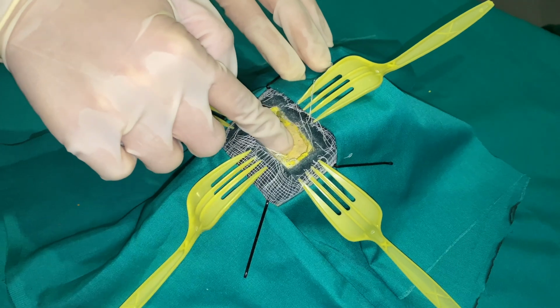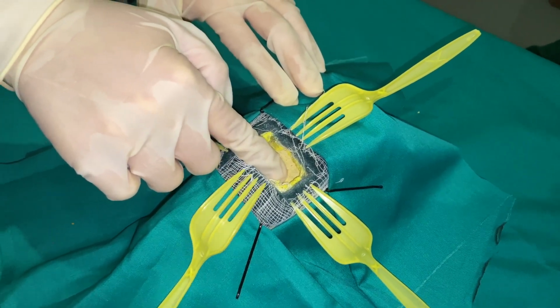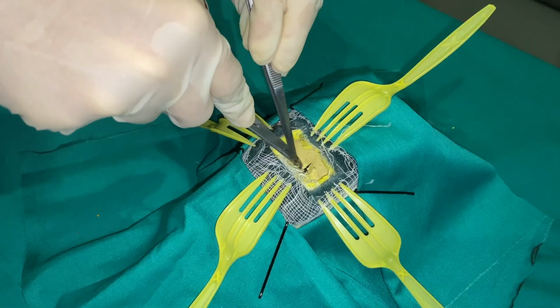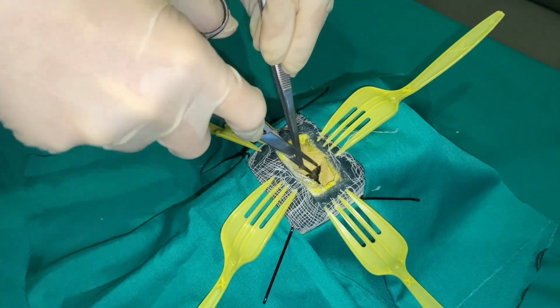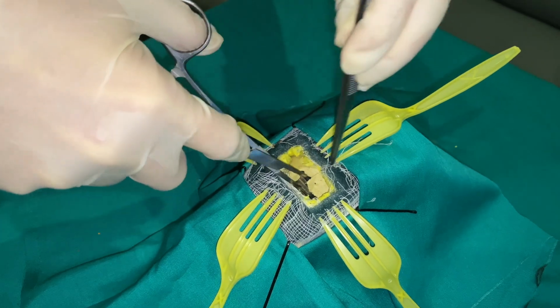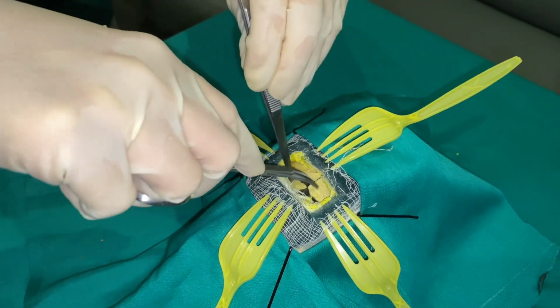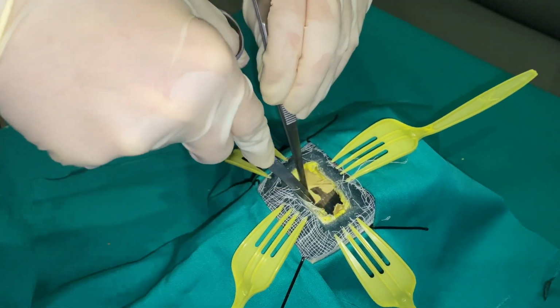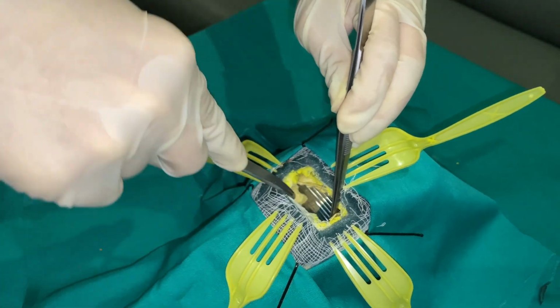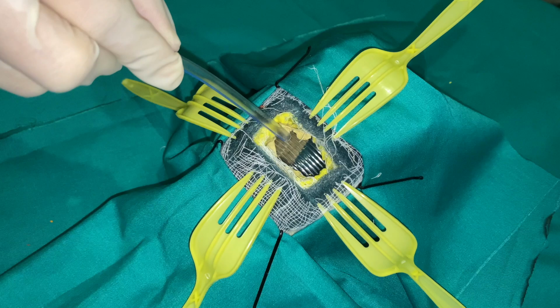If the thyroid isthmus overlying the second and the third tracheal rings is encountered, retract the isthmus superiorly to expose the trachea. In exposing the infrathyroid trachea, carefully part the overlying pretracheal fascia with a pair of scissors. Take care not to tear the inferior thyroid veins. Now ensure that the surgical field is completely dry before proceeding.